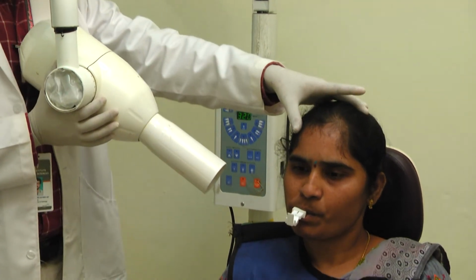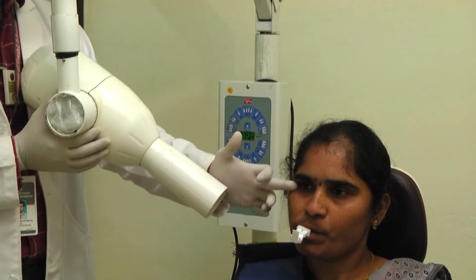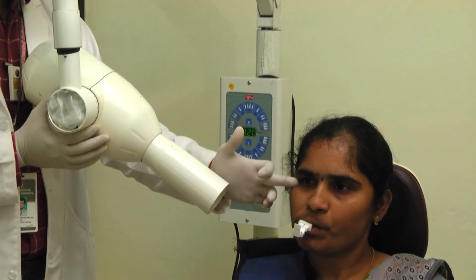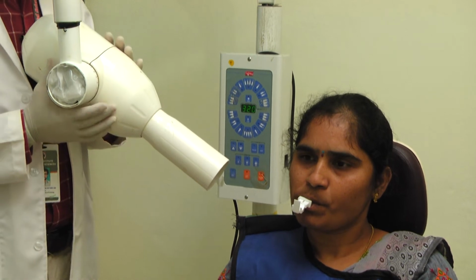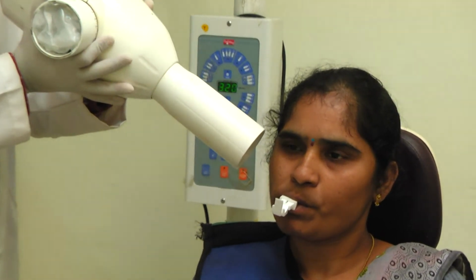The point of entry of the central X-ray beam is through the outer canthus of the eye. So this is the outer canthus of the eye. The point of entry at an angulation of plus 20 is directed just below the outer canthus of the eye. So this is the way of projection for the maxillary molars.